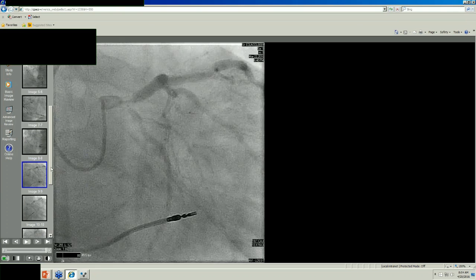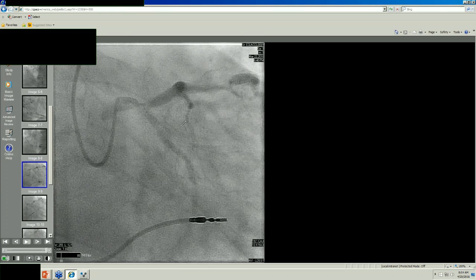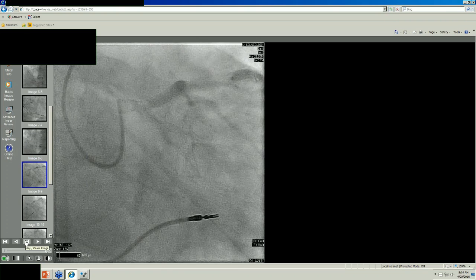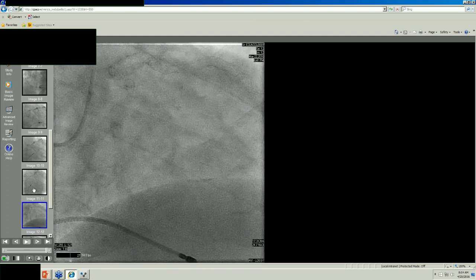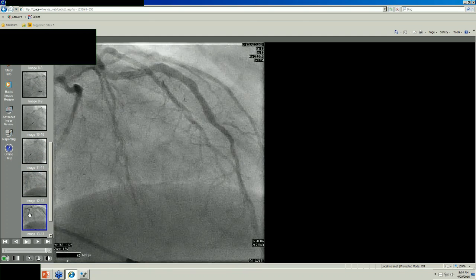This is sort of a universal catheter again, injecting the main left, and this time you can see there's severe disease now, because he took a main left that was maybe a 50% lesion, angioplastied it, and there's a stent that's extending out from the LAD into the main left, which is a messy looking thing. And so now we got real trouble. Now we got trouble, real trouble. This is real trouble. Everything else looks the same.